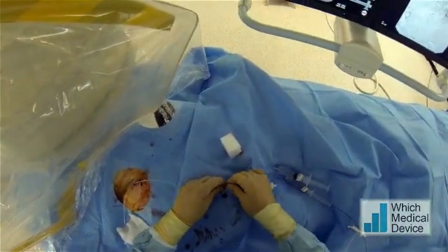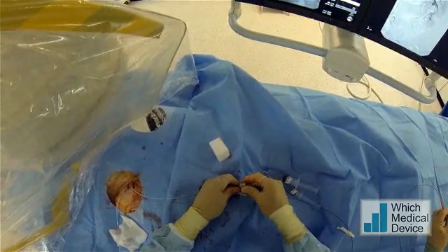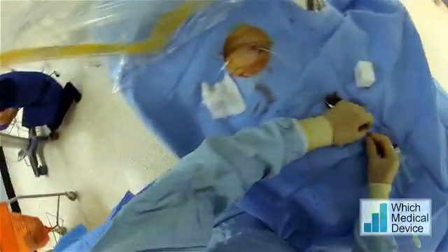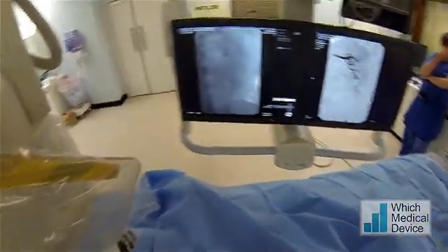We've got a 2 French Progreat microcatheter through a Tuohy-Borst adapter, which will allow me to stop the catheter backtracking as I advance the wire. The Cobra is in a stable position, and we're just going to advance the Progreat into that lower pole renal vessel.